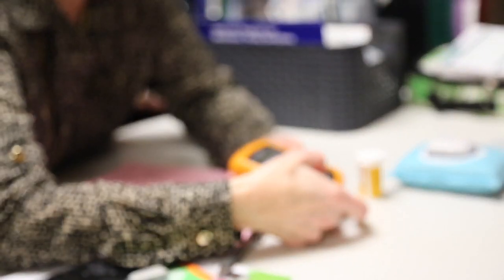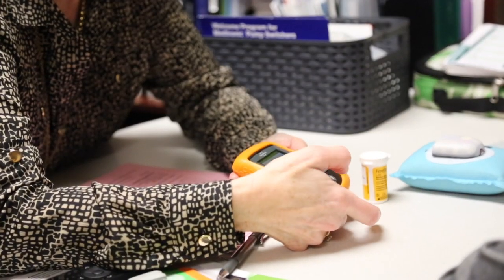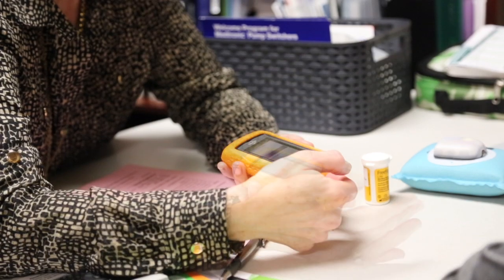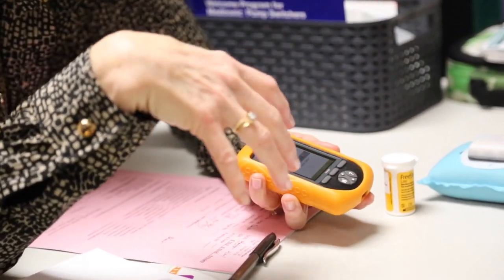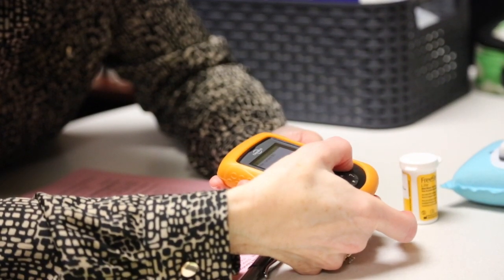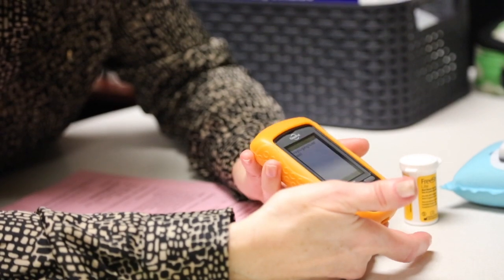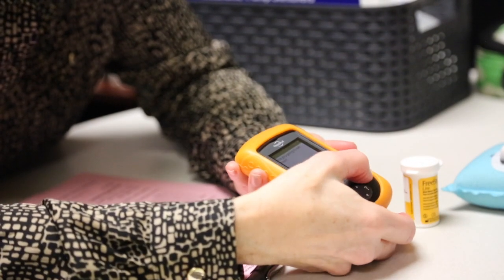Let's just put in a fake blood sugar. So let's just say that the blood sugar is 144. If you've used this for your blood sugar, it will populate with that. You'll already know. And use that, yes. Are you going to eat now? Aww. And most of the time, with an 11-year-old, it's going to be, yes.